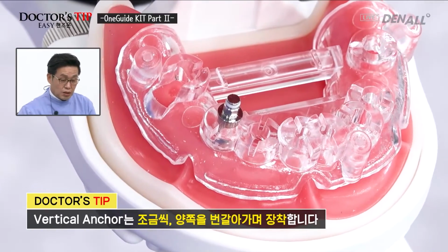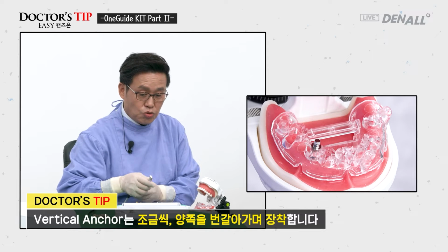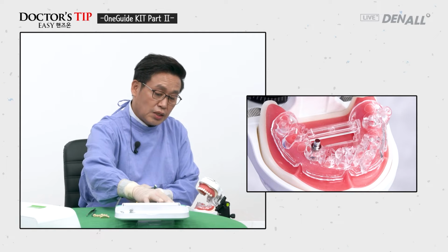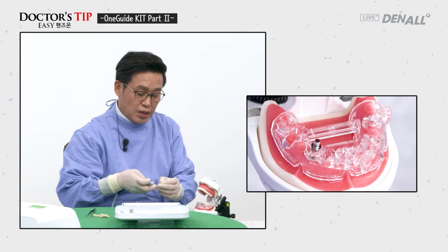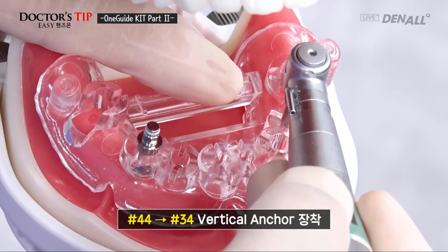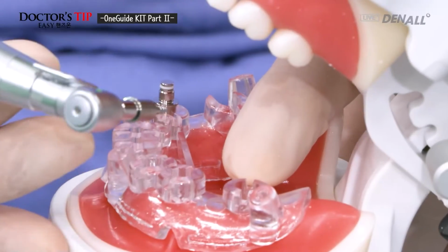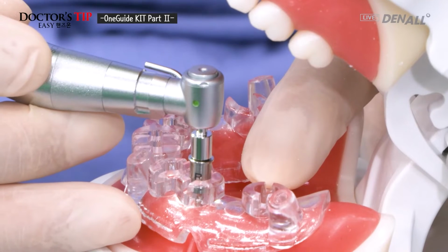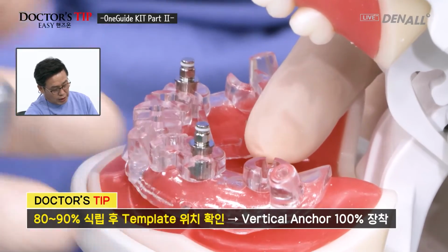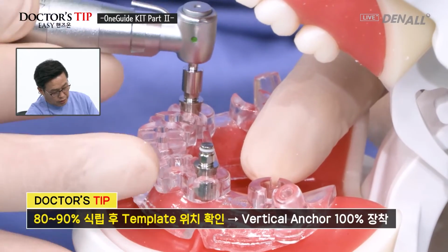Do a little bit, and I'm going to do the other side. This is so that stent is not tilted and is fixated well. As you can see, drilling is done. I'm going to change to drilling mode on number 34. Drill hole is made and vertical anchor is placed on number 34. So once these 2 are 80-90% in, check the template position and then mount it fully.